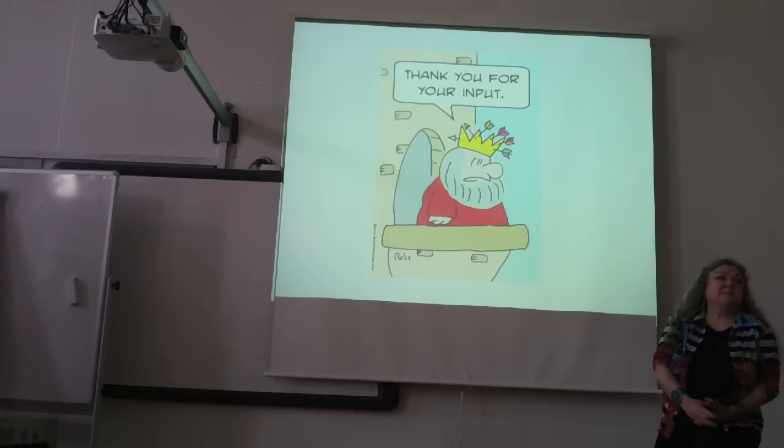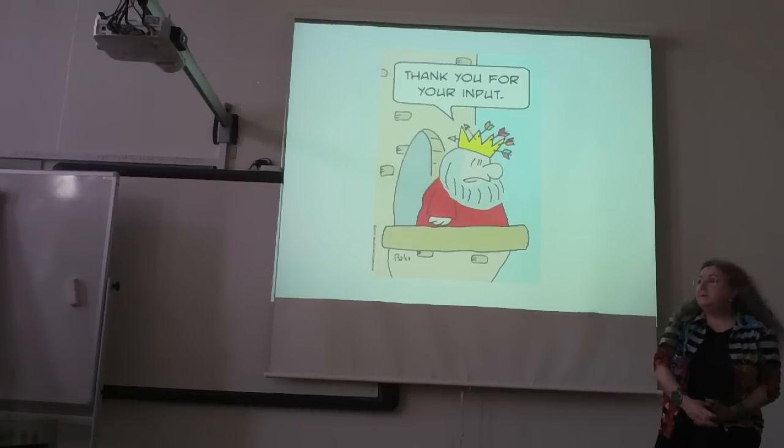That sound, was that only when they touched? It was like a slap, or what do you hear? Yeah, well, you saw several vocal breaks. I think the first one was from male flageolet to overdrive. This is actually the one where we all heard a very fast, quick, abrupt change acoustically, but we saw a smooth transition.